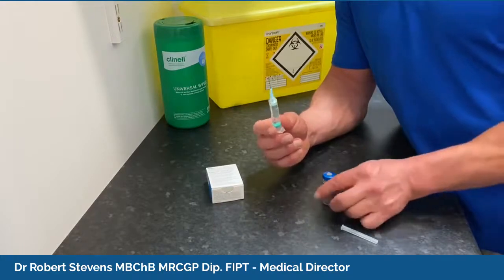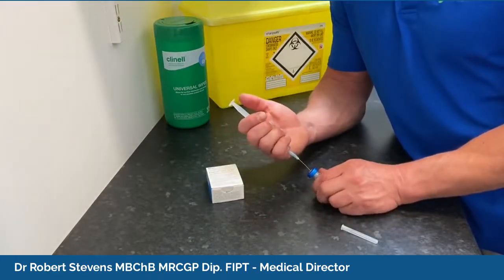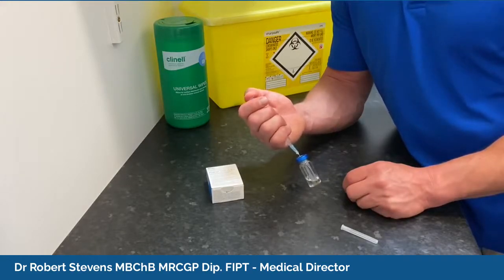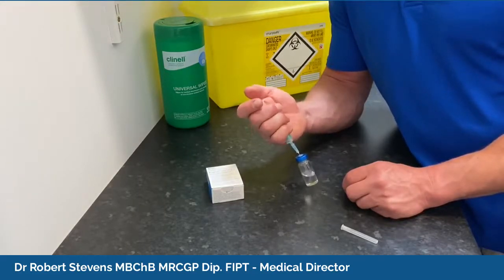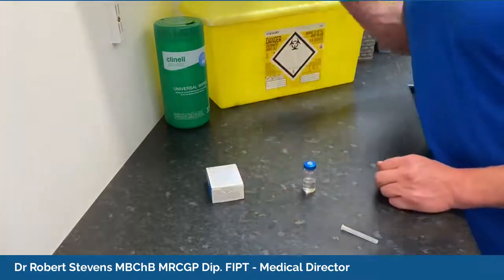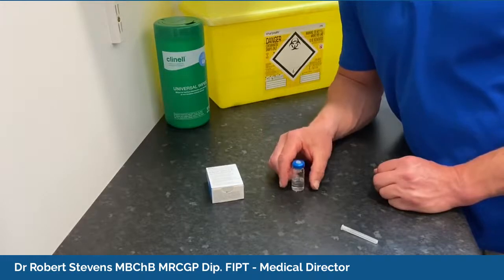What we're going to do is obviously put it back into the vial. Again, central ring. Depress the plunger nice and slowly. So I always take the plunger back up to 5 and then take it out, dispose of your sharp. You've now got a new HCG vial.